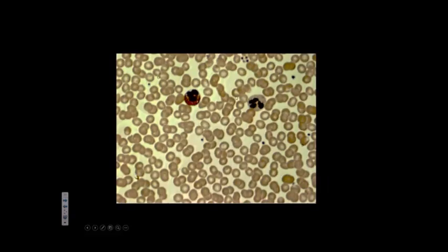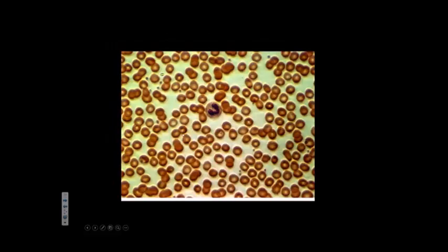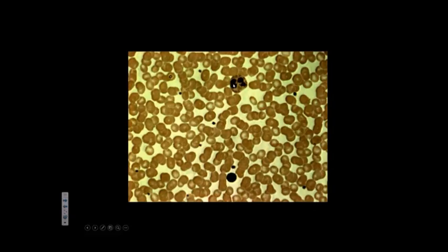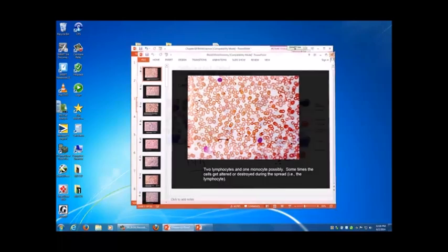Monocyte, okay. Eosinophil, lymphocyte, neutrophil, lymphocyte, right. I don't know what I just said. Okay, so this looks like a neutrophil. Possibly, more likely a neutrophil. Not sure what that is, I guess. Basophil, monocytes, basophil, and that. Okay, so that was kind of fun, right?